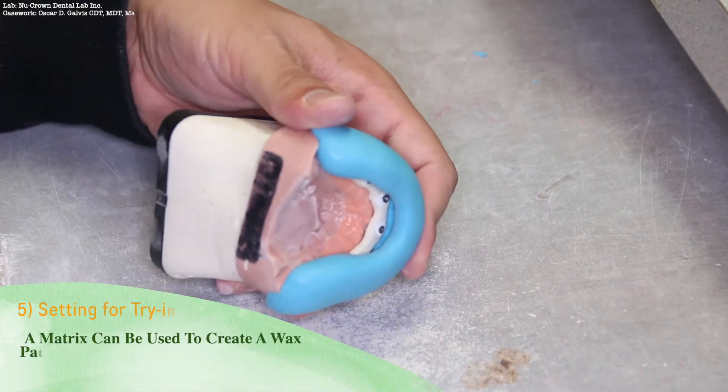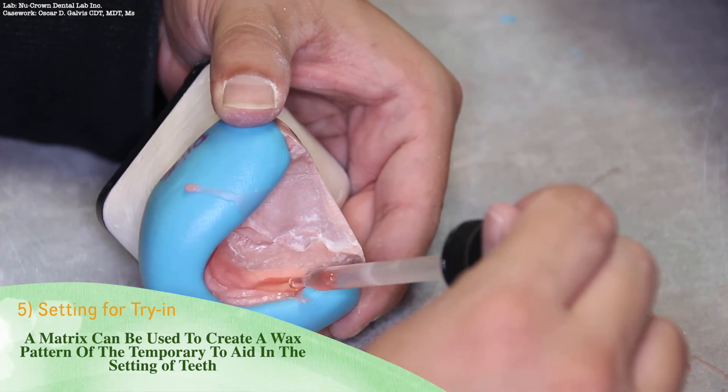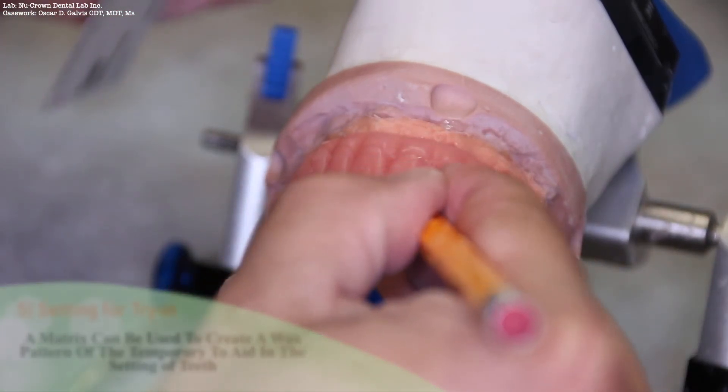Using the matrix, you can create a wax pattern of the temporary restoration to aid in the setting of teeth, or even to use as a plug-in for the denture teeth of a previous setup. At this time, you may set teeth and wax as desired.